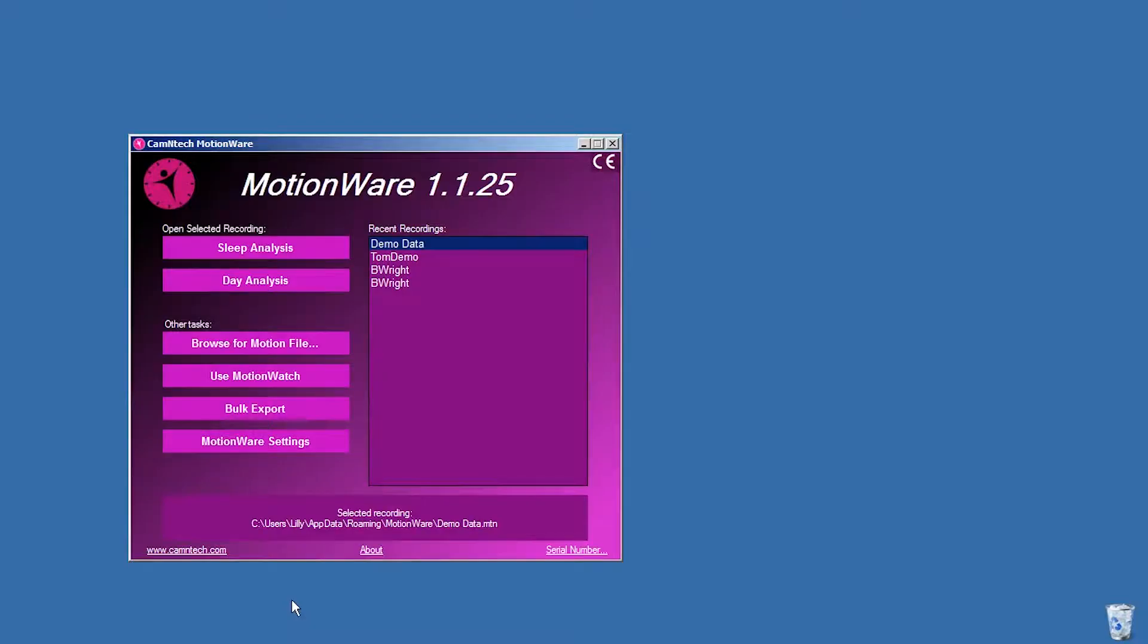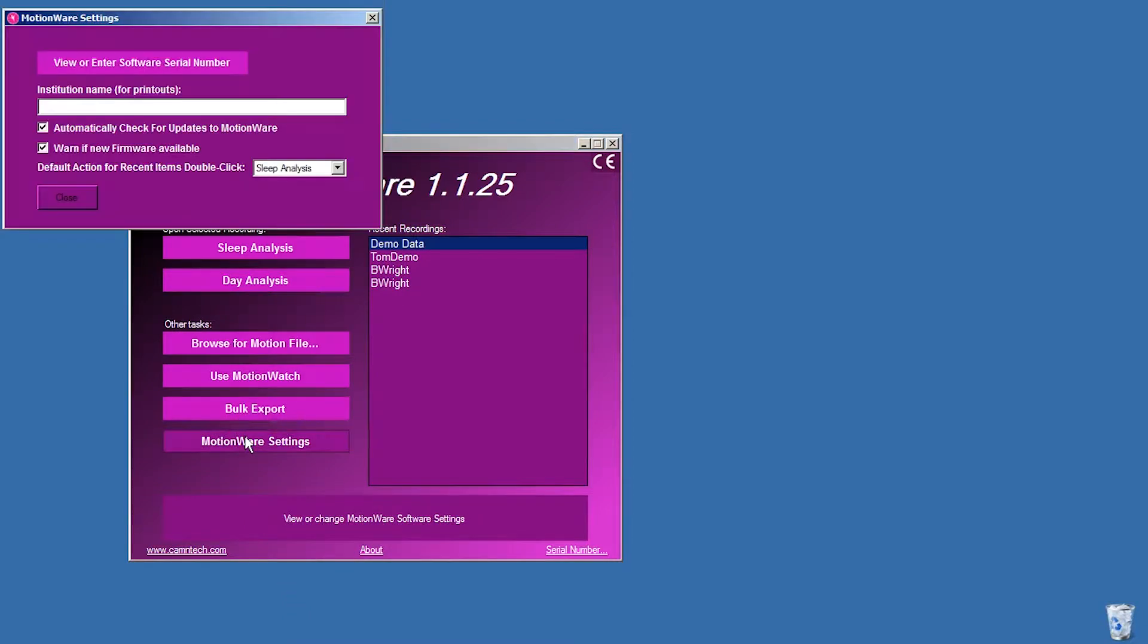Once Motionware has been installed, you are ready to use the application. Click on the Motionware Settings button on the startup screen to open the Motionware Settings window.